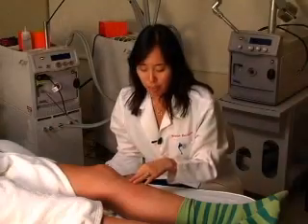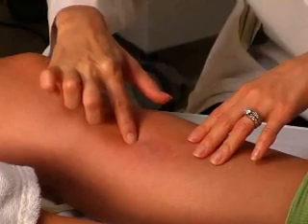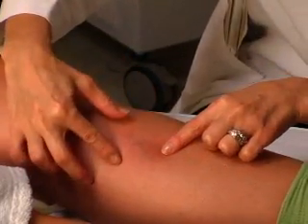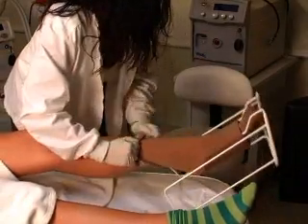We just finished up injecting her veins and as you can see it looks a lot better. Over the next few days it'll start looking worse and it'll start getting purplish and looking bruised. The way that we keep them shut the best is by using support hose and by walking.